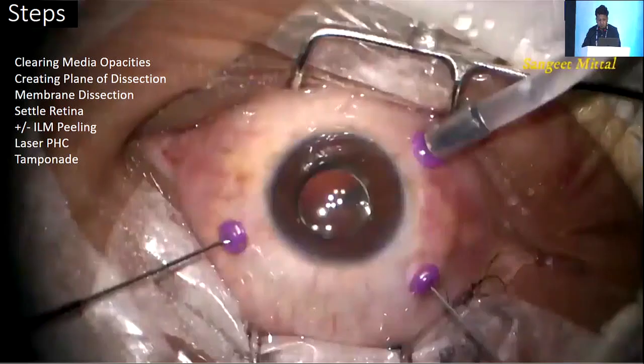The various steps of doing vitrectomy in diabetic retinopathy include, first of all, to clear the media opacities.